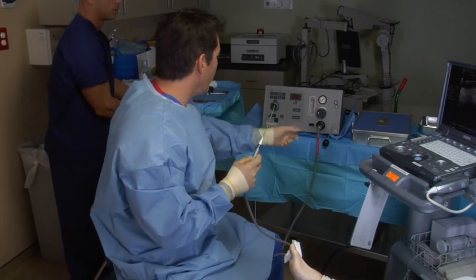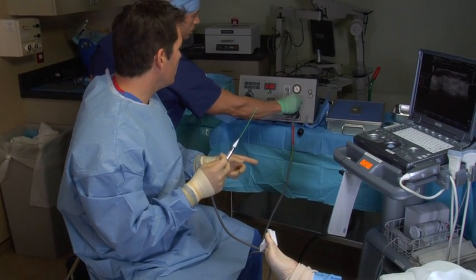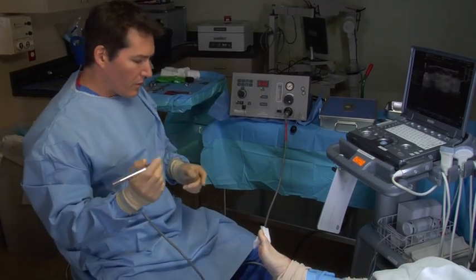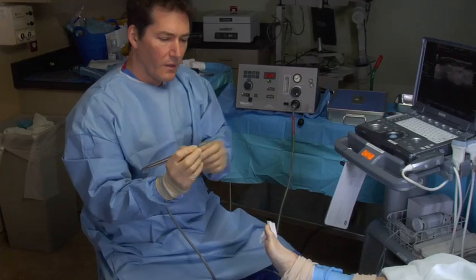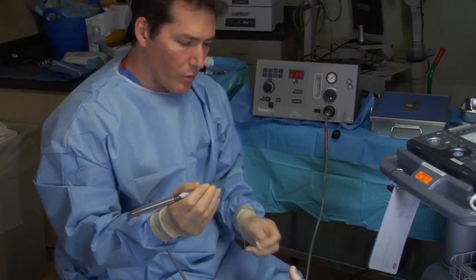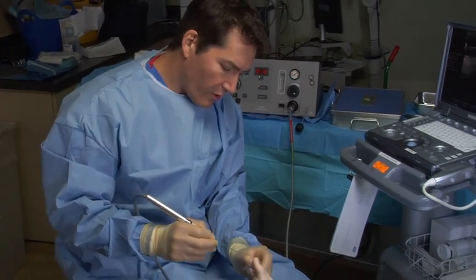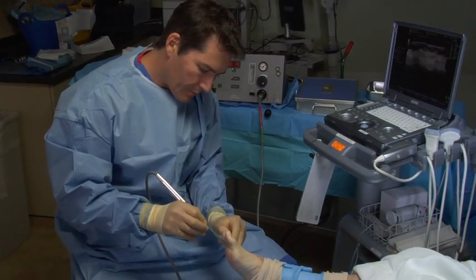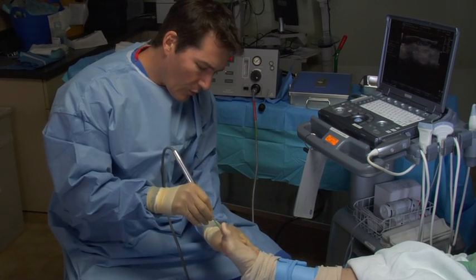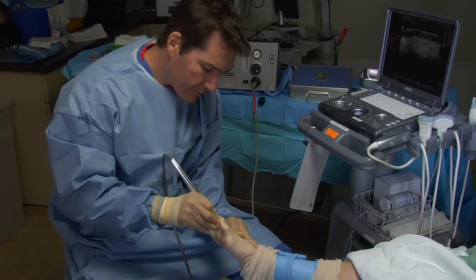And let's turn up the pressure. Just keep going. Good. Good. Beautiful. So this probe has a tip that forms an ice ball on it. And all we're going to do is insert the probe beneath the deep transverse metatarsal ligament through the little incision that we made. And what that allows us to do is to get right on the nerve.